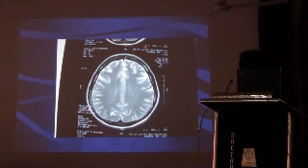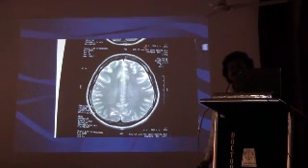So now we are again looking at TR 3000, echo time around 100. So this is a T2 weighted image that we have. Clear?